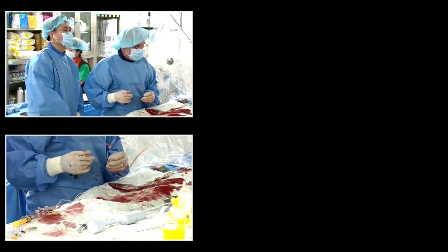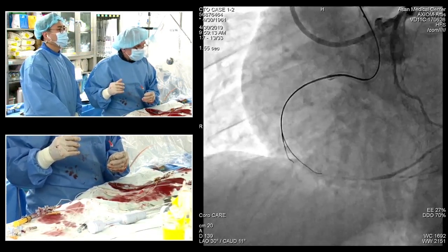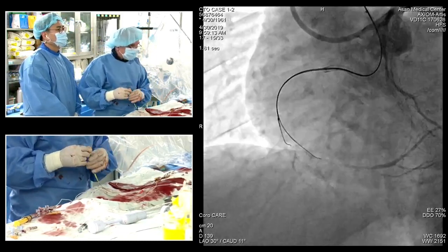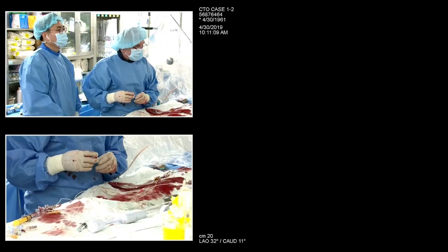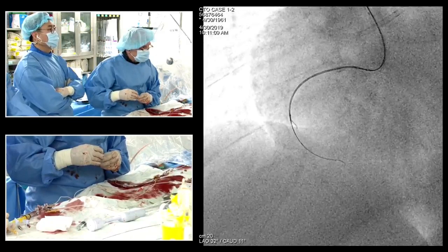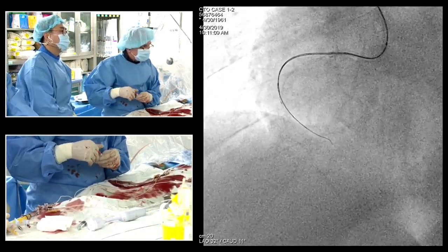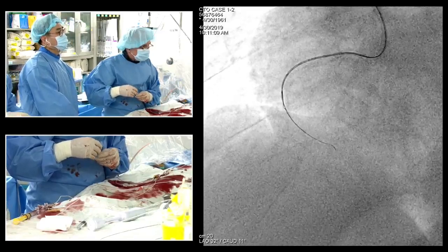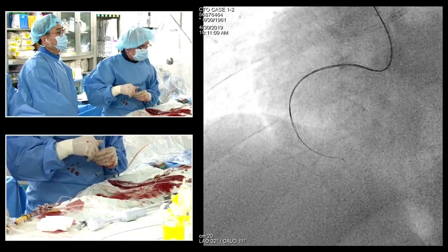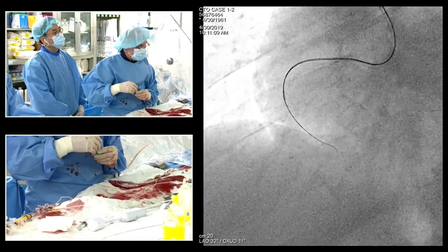Forward. Yeah, no, back. That looks really very close, but it's not in. So I'm presently in the position where I have two Confianzas, one very close, and the other will never get as close as the first one. There is some problem in the passage, and I need to get the incentive to start retrograde, I think. Someone needs to tell me, stop.